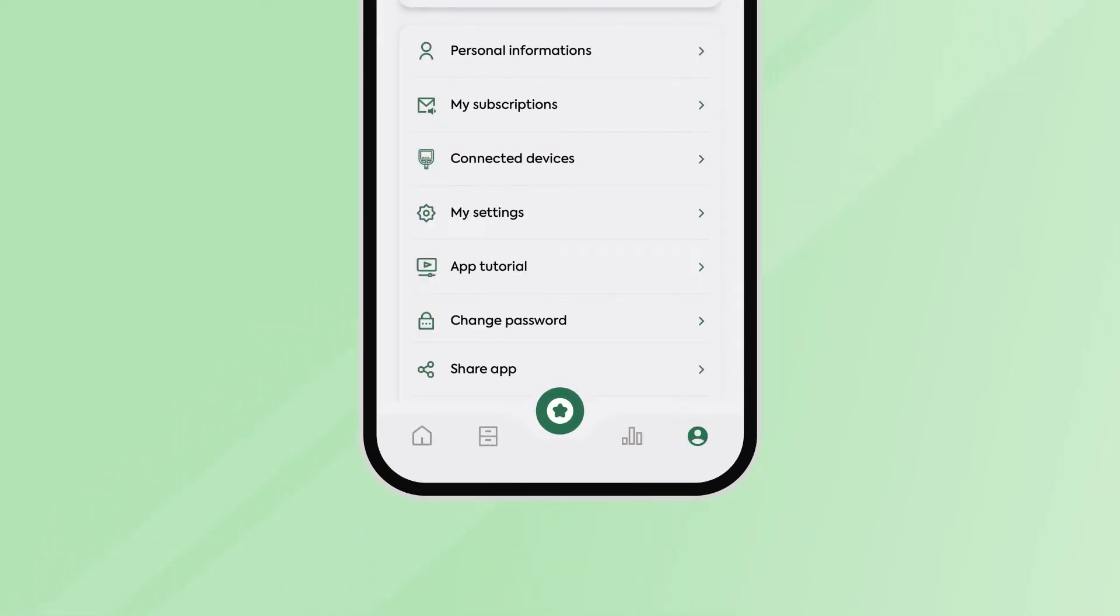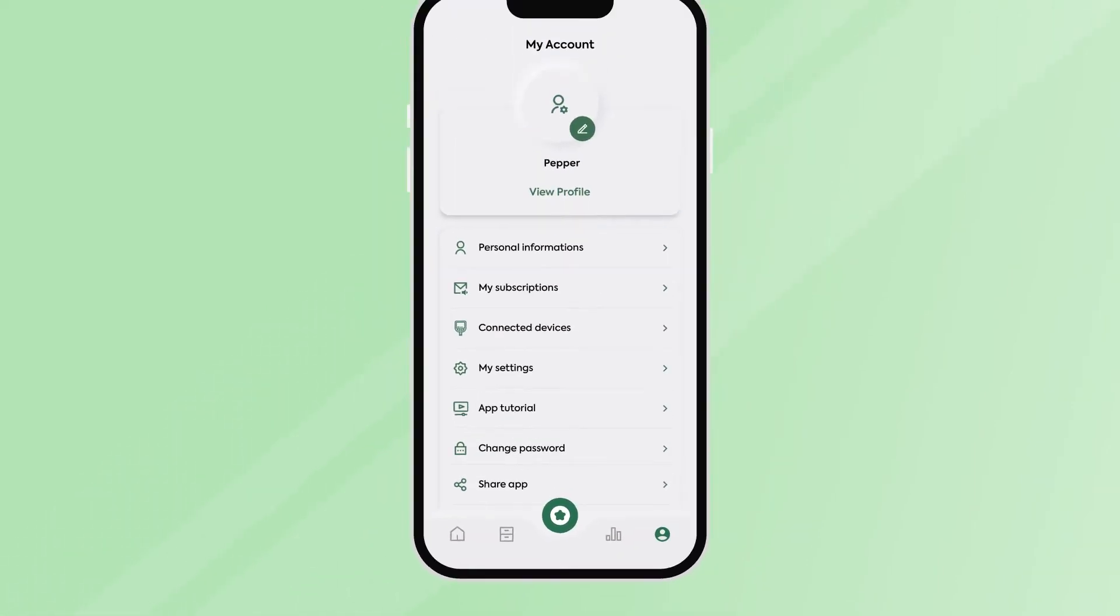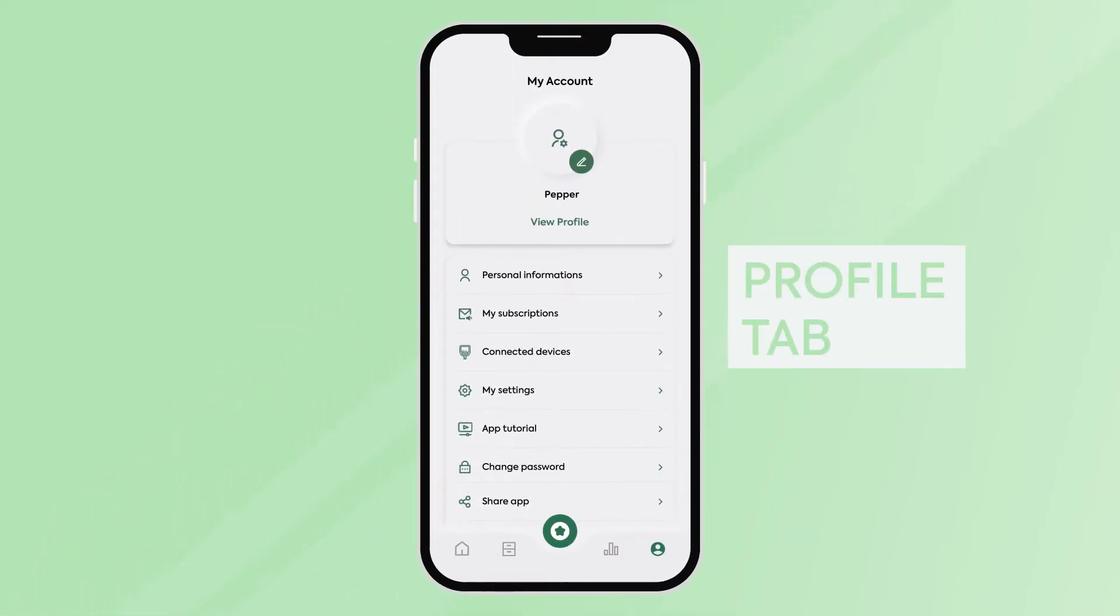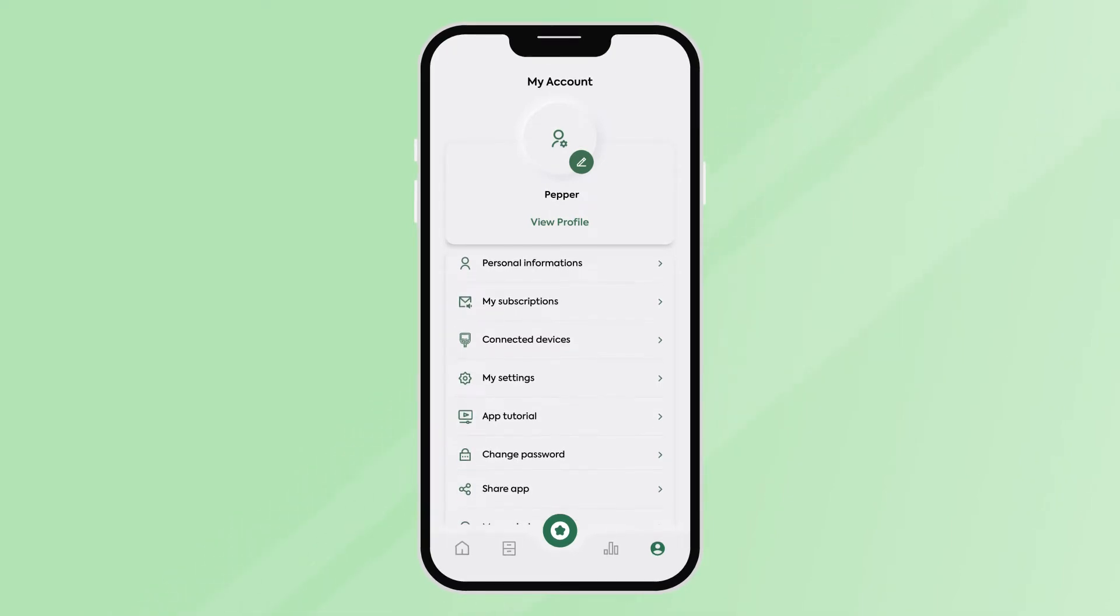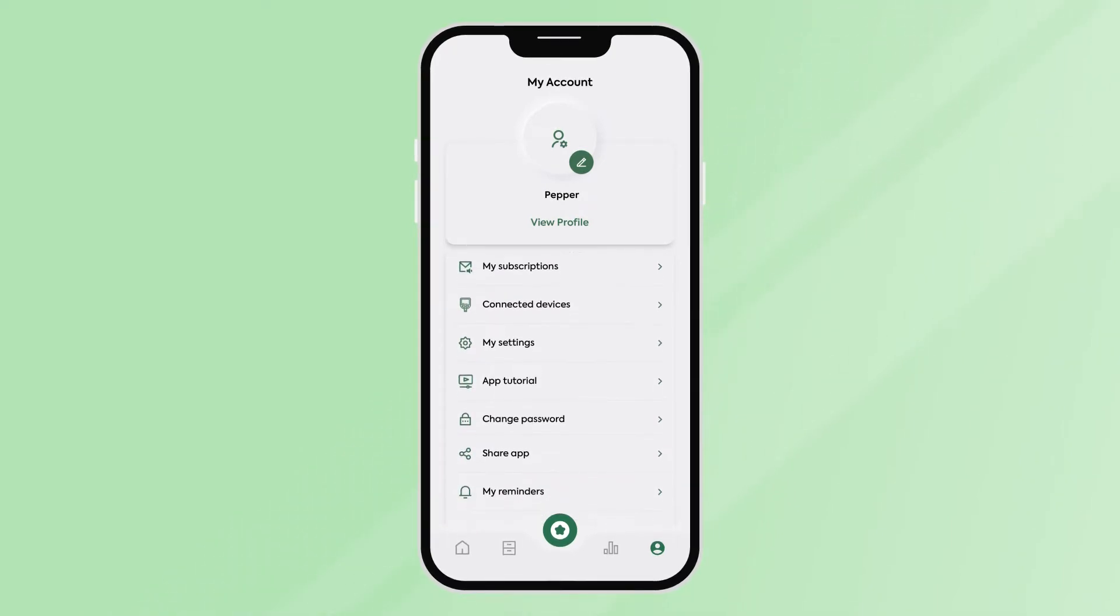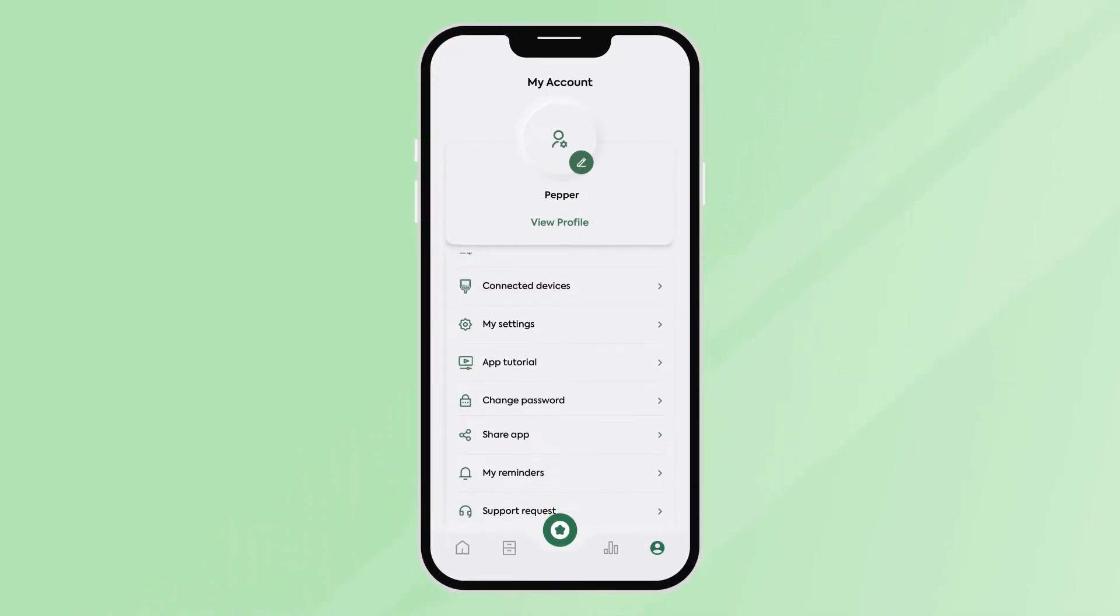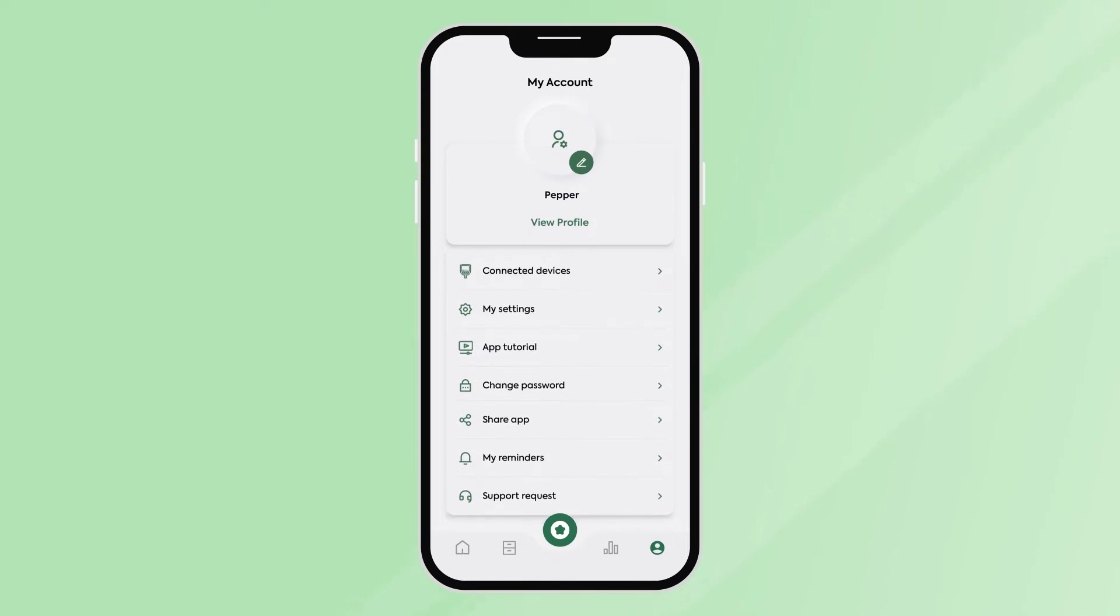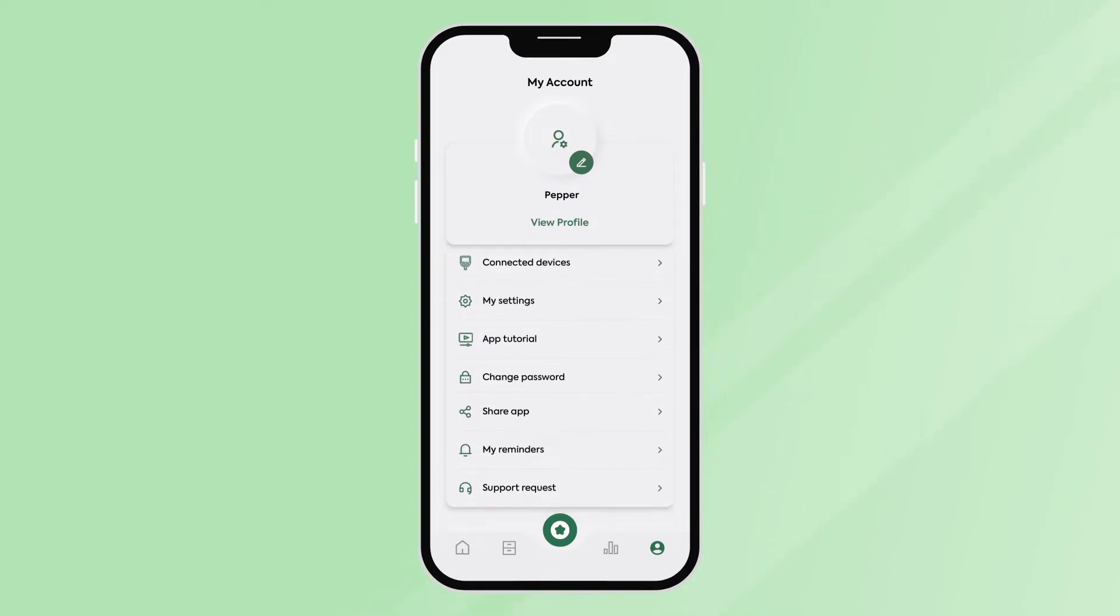You can edit your profile, personal information, and change your password in this tab. You can also purchase more test strips, manage connected devices, add reminders, and edit your settings.